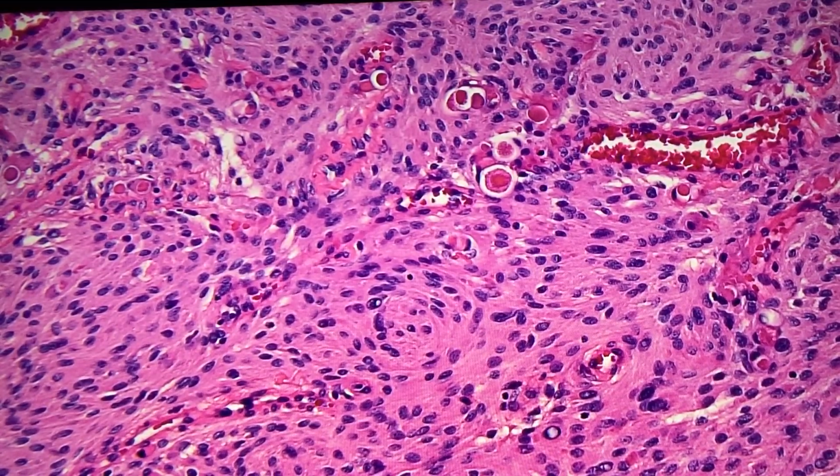So does it make a difference whether it's a garden variety meningioma or secretory? Does the fact that it's secretory change the grade automatically or no? No, this is grade 1 by definition, unless you were to find other features like brain invasion or mitotic activity, but unlikely. So other than the brain edema correlation, there's no bad prognostic significance. Okay.